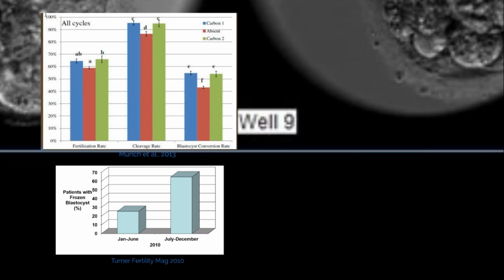I also like to point out mineral oil and paraffin oil, for all practical purposes, are the same product, at least the way we label them, and they're a valuable product for how we culture. The majority of us need to use mineral oil, but it is the riskiest one, and one that I always look to first whenever I see a shift in, say, blastocyst use rate. I will right away look and see if there was a change in our lot of mineral oil.